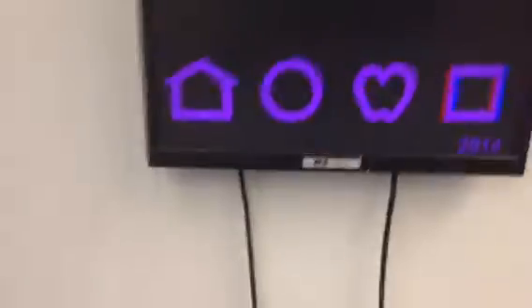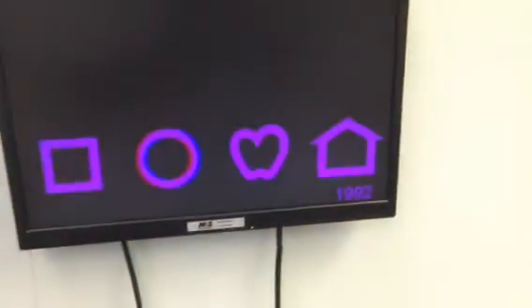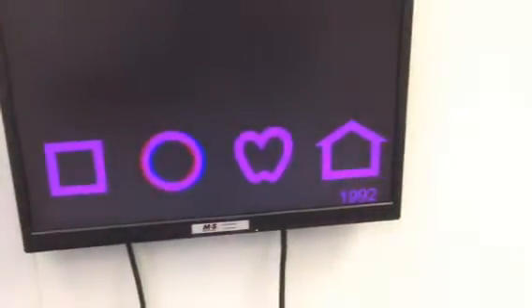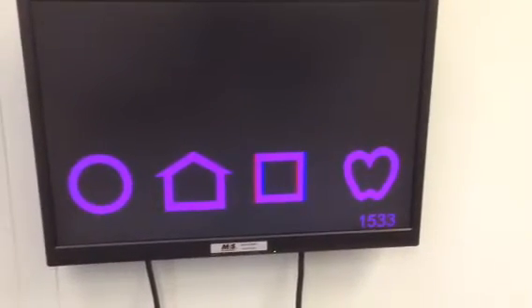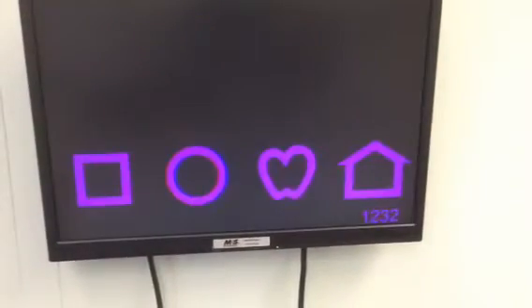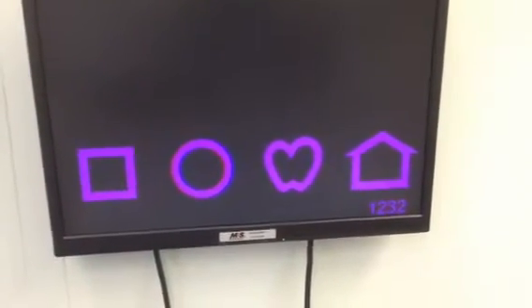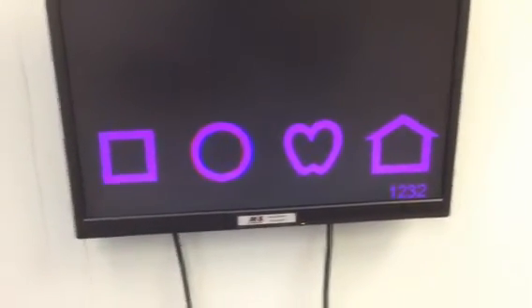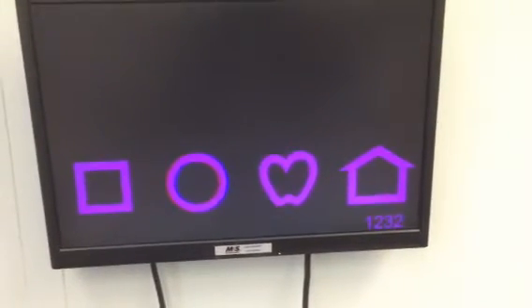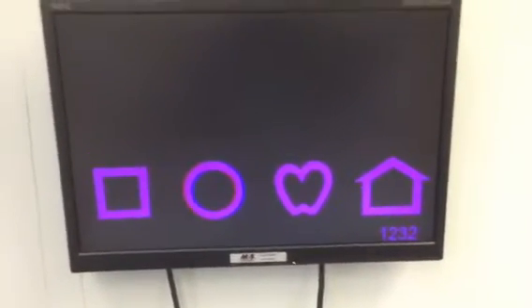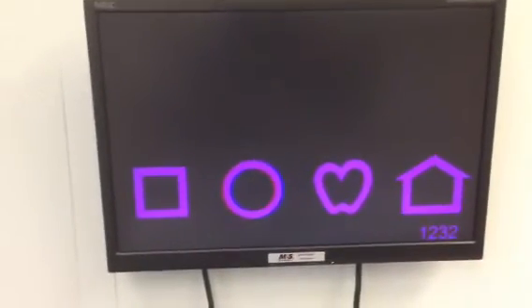So if we change it to use up and down we're going to see hitting down or alt down that the demand changes on our screen. And that works for either one of these targets. And you do that until you reach threshold.